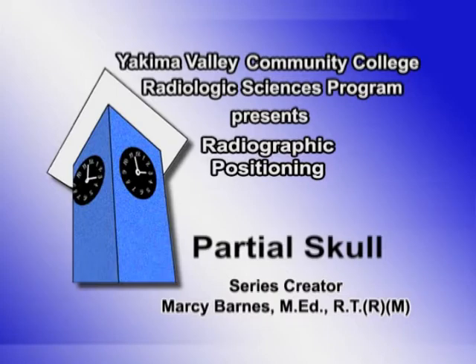Partial skull. We're going to center our attention today on a skull procedure, and I'm actually going to focus on a partial skull procedure. More and more CT is taking over these exams, so for you to see a partial skull, it may or may not happen, but you need to know the basics.